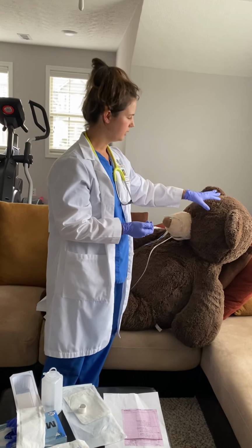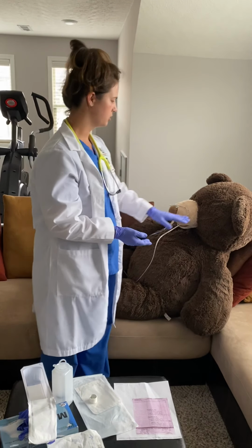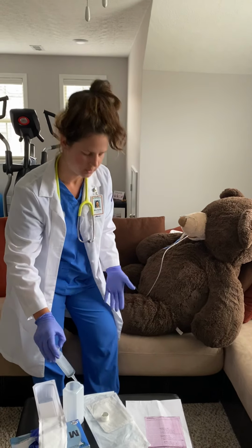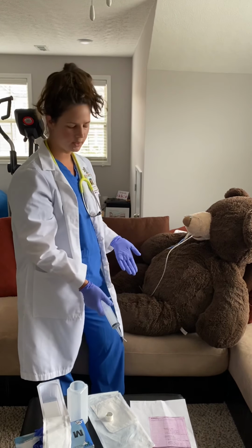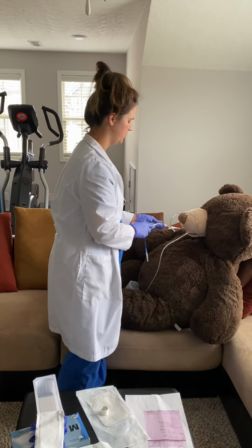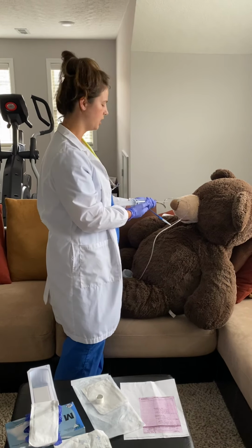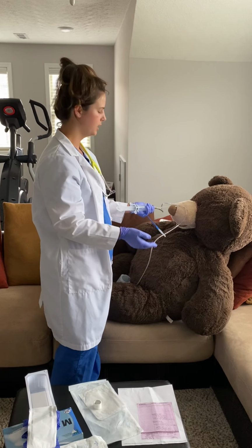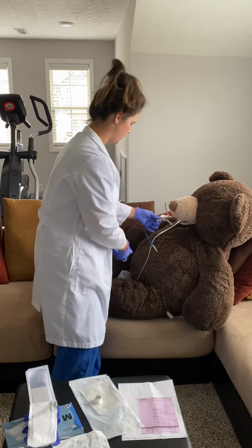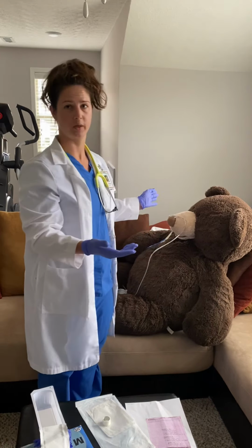And you want to make sure that with feedings, you never lay them down because it puts them at risk for aspiration. So make sure they're in a Fowler's or high Fowler's, and you're going to be checking the residual first before any feeding. Per this order, you're going to be checking the residual here. If it's less than 150, you're going to return the contents to the stomach and proceed with the feeding. If it's over 150, you're going to hold the feeding and the contents. Do not go back to the stomach. And you're going to notify the doctor and see what they want to do from there.